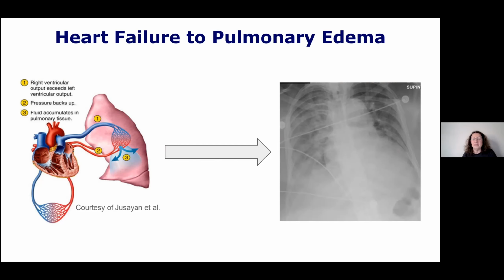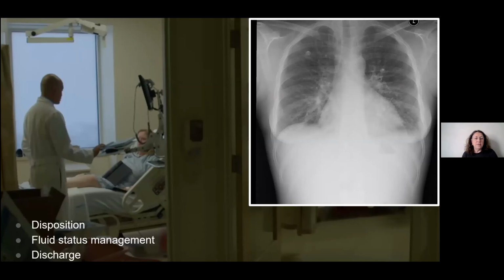Chest X-rays are used as one of the first diagnostic tools when somebody comes into the emergency room and complains of shortness of breath. On the picture on the left is one of our collaborators, Stephen Horn, and the patient. Steve is an emergency room physician. When he gets a patient who complains of shortness of breath and chest X-rays are taken, there are several decisions that have to be made under pressure of time. These decisions have to do with whether to admit, and with the path that this patient will take through the hospital system.